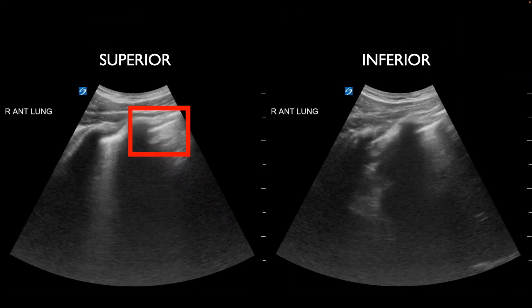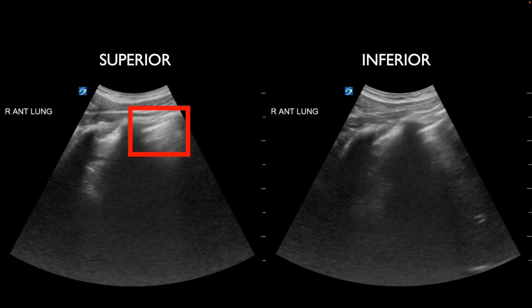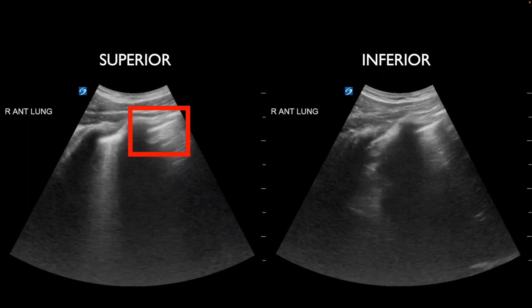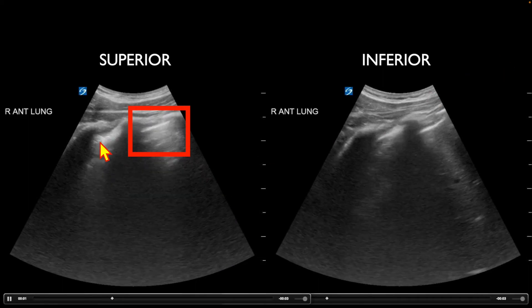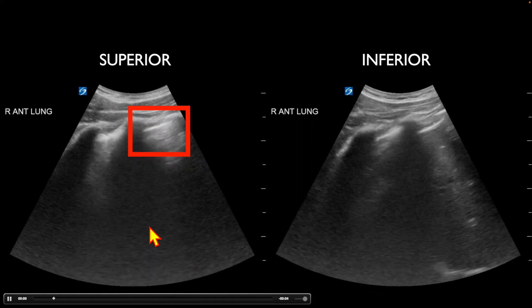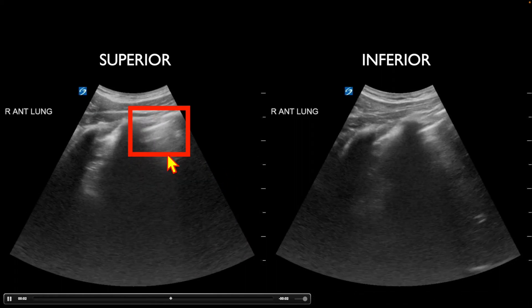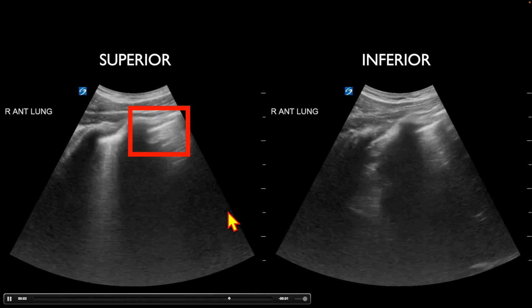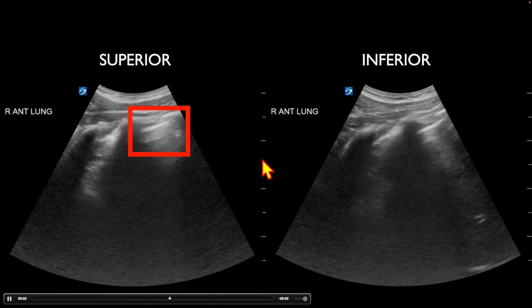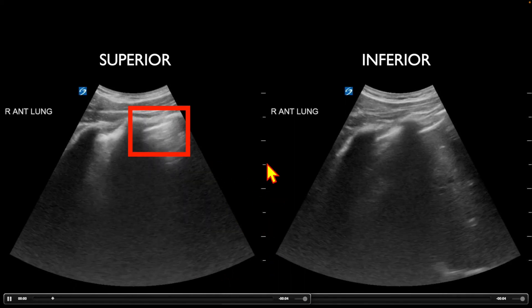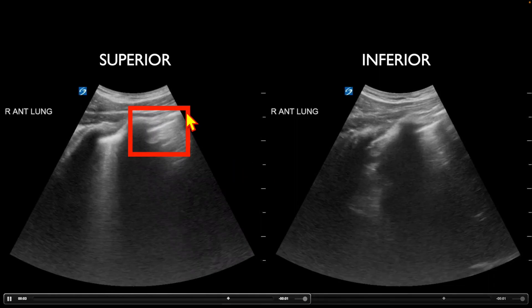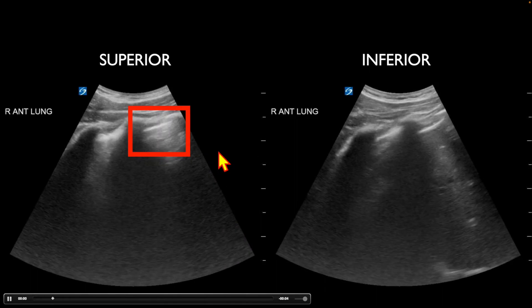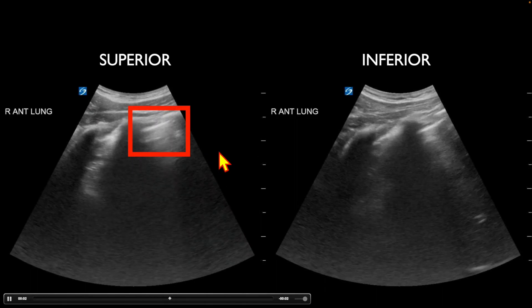The next thing I want to bring up is that we could also have a depth issue. If you remember, we were at about 17 centimeters, and that's good for when we want to diagnose pulmonary contusions, which it appears this patient had. But it can make it difficult to appreciate lung sliding. So we can do a couple of things: we can drop the depth significantly — if this was at 17, we could drop it to 8.5 and probably get a better view. We could also put a zoom box on this and focus on just this area, and both of those things would significantly help us.